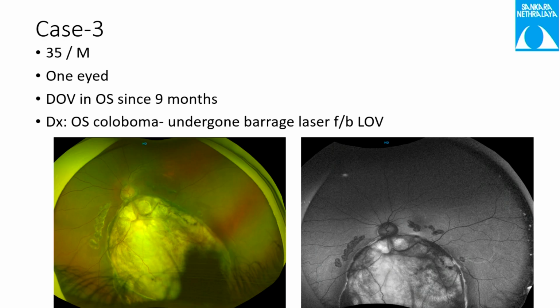So here we can see that the laser burns are put on the nasal side. Here we can also see that the burns are involving the fovea, which is evident on the second image better. So this is the reason for his drop in vision. His vision currently is 6/18 and N6. Luckily his near vision was okay.